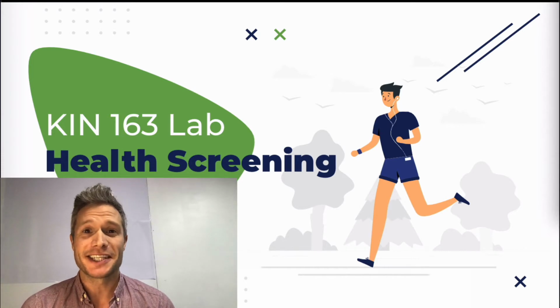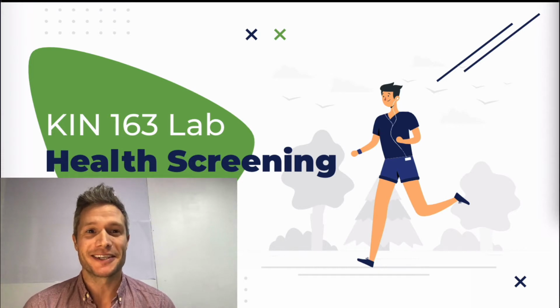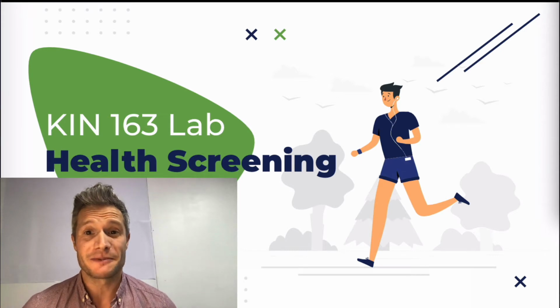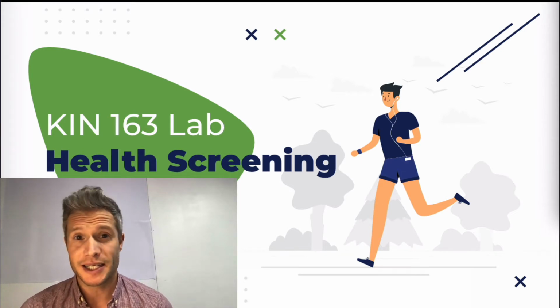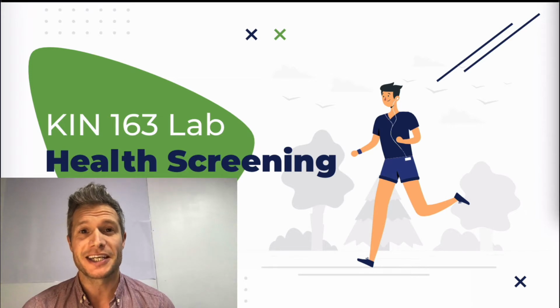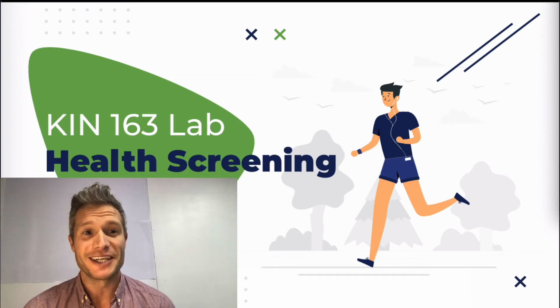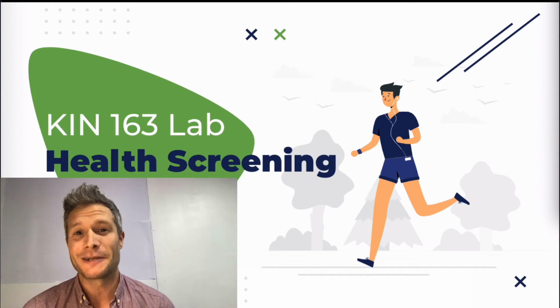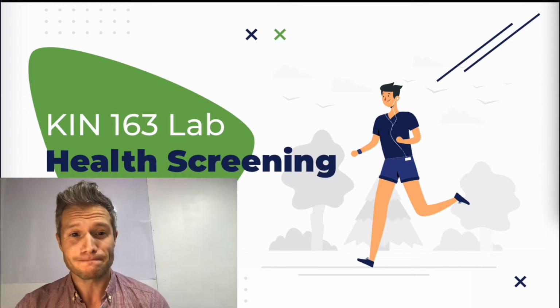I'm excited about this lab because it's often most people's favorite lab as they get into the health professions, because it's their first introduction to the first steps of working with people. So taking histories and getting questionnaires and forms filled out, but also taking some cardiovascular measures, which can be a little frustrating for some at first, but if you stick with it and practice it, you end up getting quite good at it, and it's kind of fun.